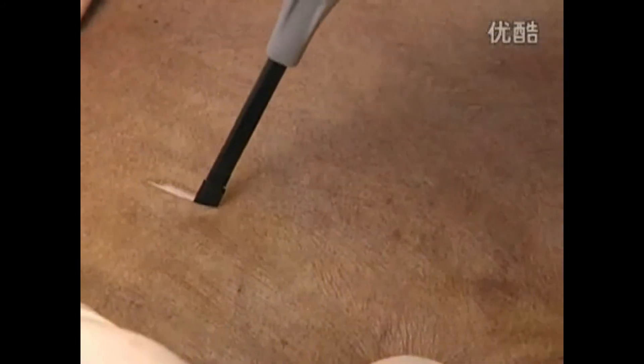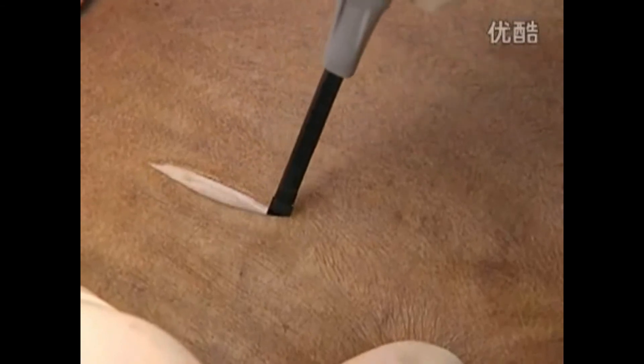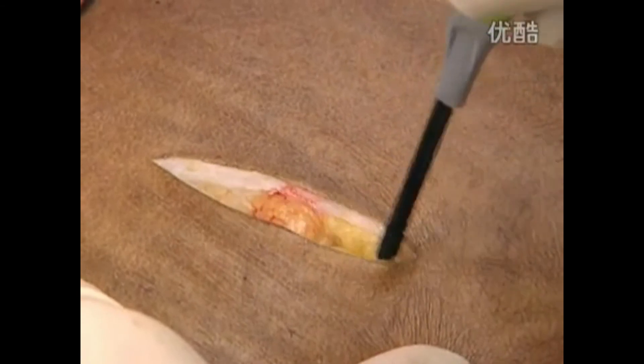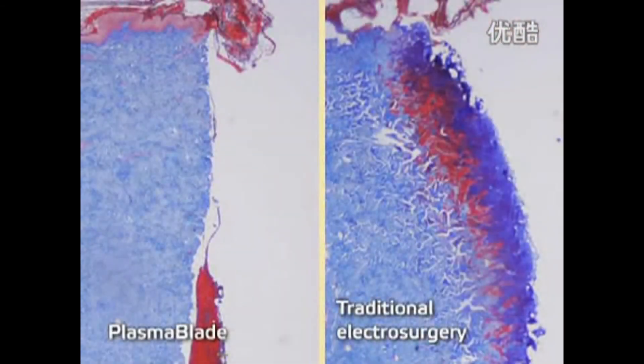The Peak Plasma Blade provides surgeons with greater control, resulting in significantly reduced amounts of damage to surrounding tissue. This preserves healthy tissue and results in improved surgical incision wound healing.